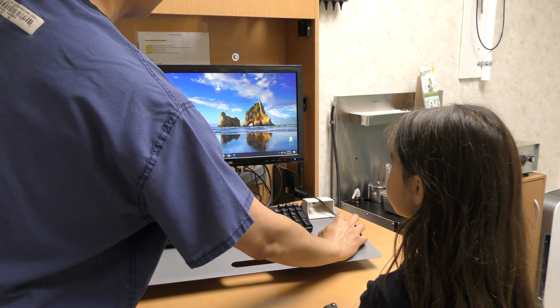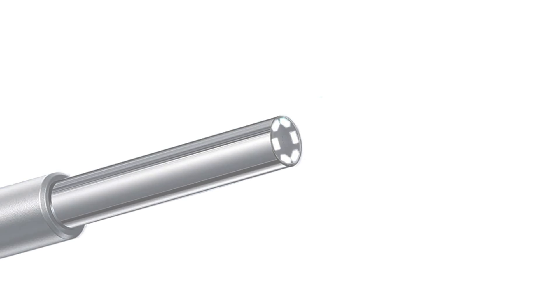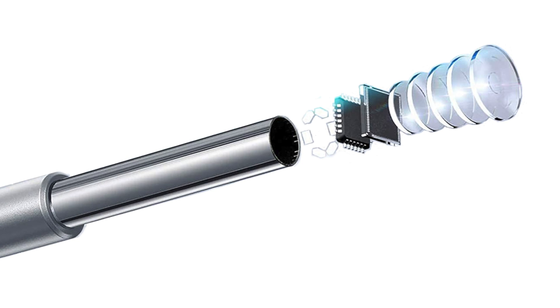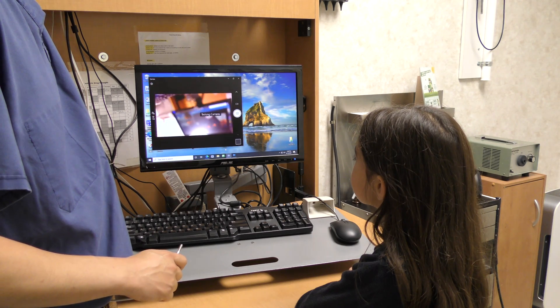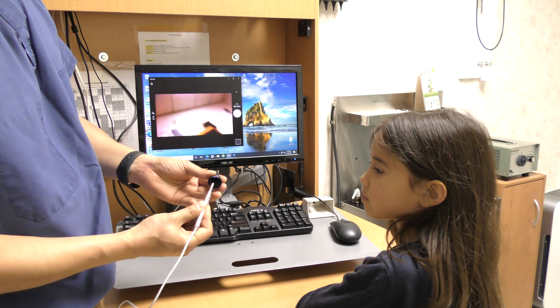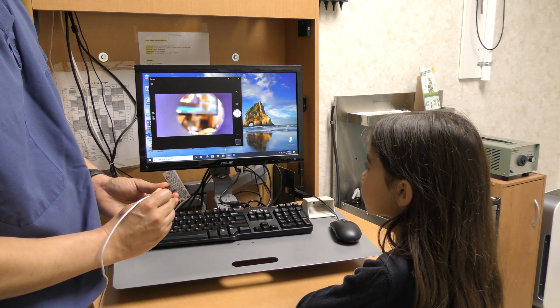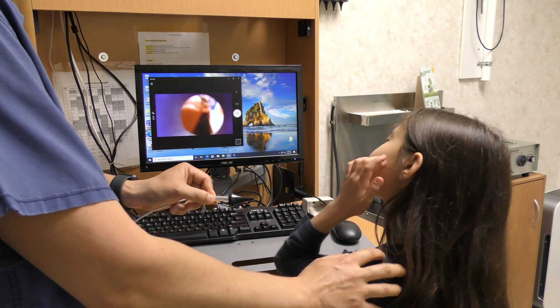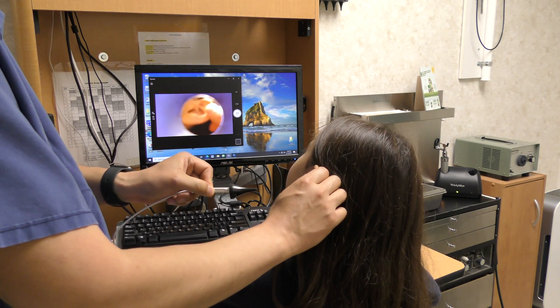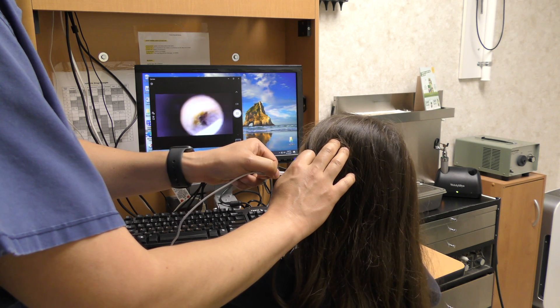The digital otoscope can use any camera app, including the one included free with Windows. Digital otoscopes have a fixed focal length of about 2 to 3 centimeters, a viewing angle of 70 degrees, and a depth of field of 20 to 30 millimeters. The diameter of the camera itself is about 4 millimeters, so any 4 millimeter standard ear speculum fits perfectly. The camera produces a 720p 1.3 megapixel image.